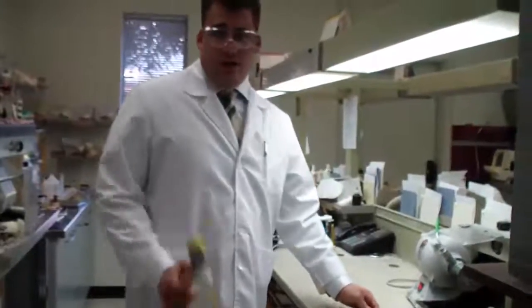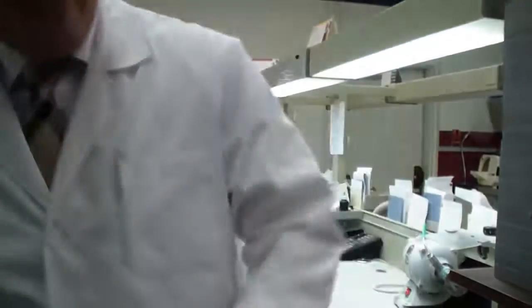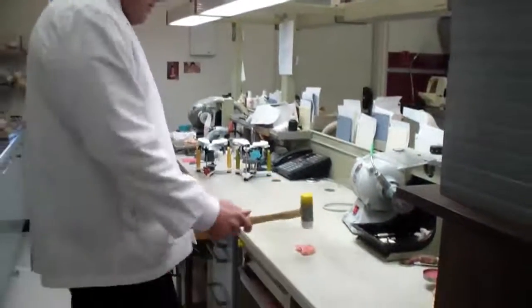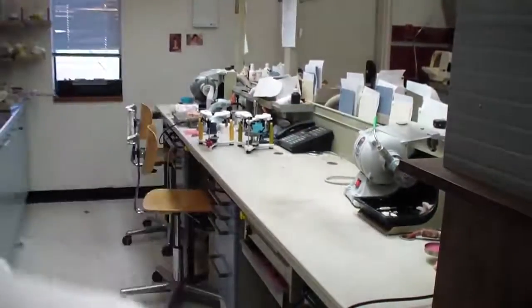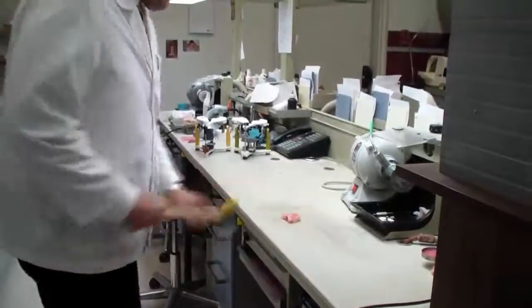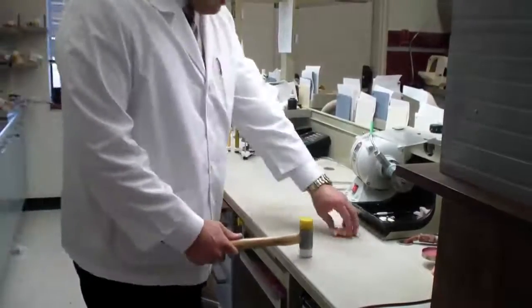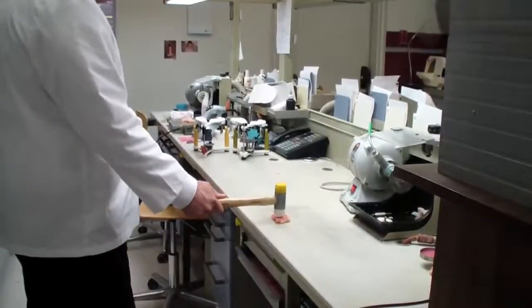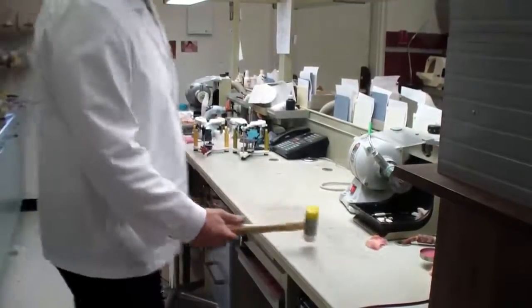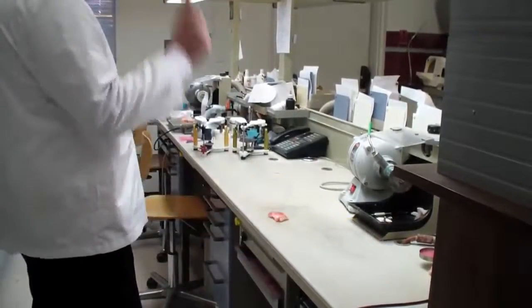Next is the SR IvoCap Fiber Force Reinforced Denture. Just to show you that there's actually Fiber Force in there. Nothing — first hit had no effect. Somewhat of a crack on the second hit. Third time's a charm — it's not completely in half yet. Now it is.